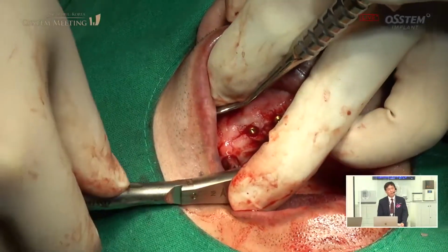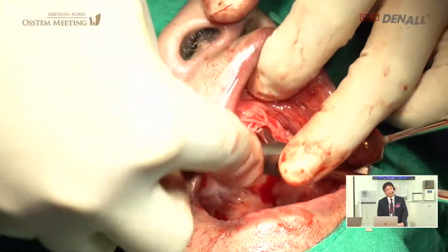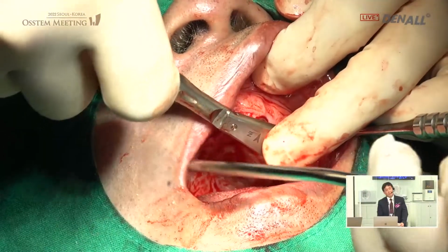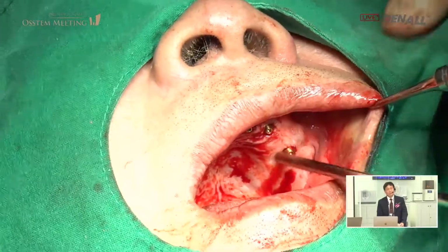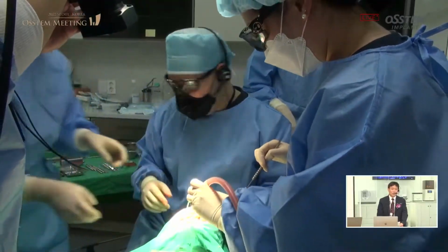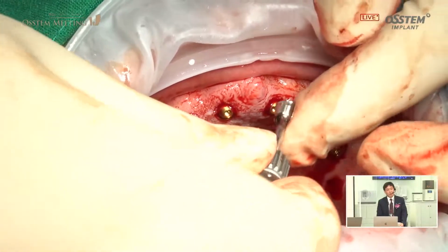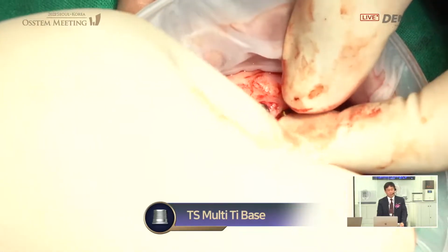Torque wrench clicks. The number 15 is the area of concern. My gloved hand is contaminated and the metal driver feels slippery, but I prayed a lot last night, so it went pretty well. At number 15, which was worrisome, the initial drill went okay. TI base is connected.